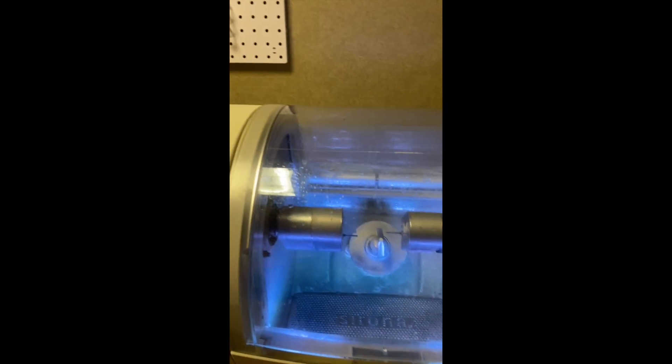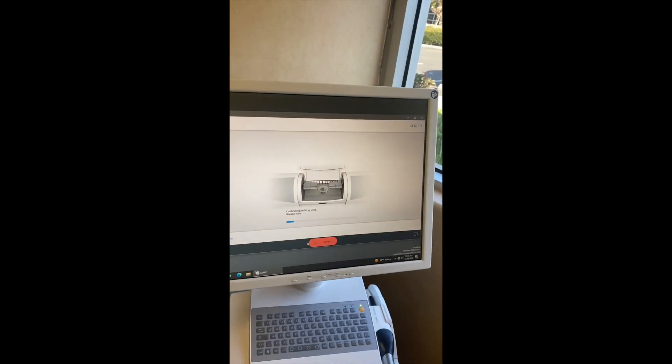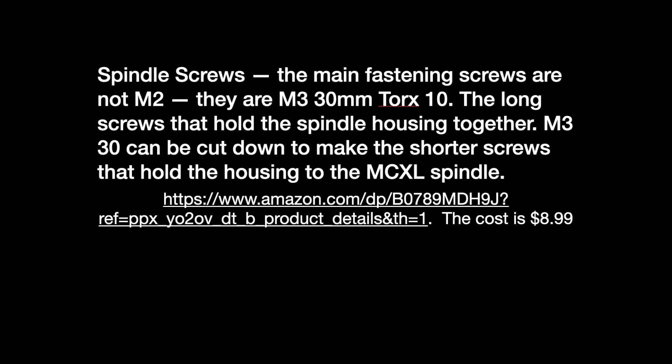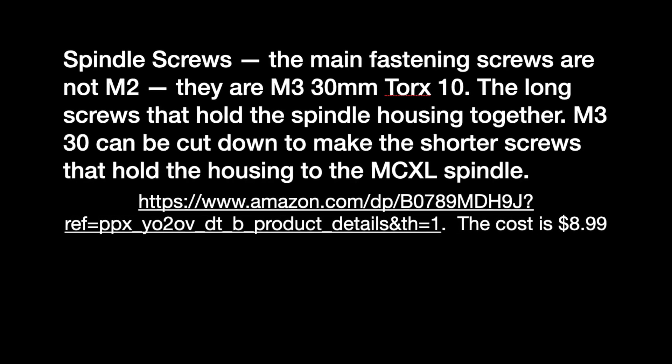It's very important that after you finish installation of the new spindle motors, you run through a calibration sequence. That's what we're going to be doing here with this MCXL — checking the calibration. There might be minor changes from swapping that motor, probably tenths of millimeters, but you want to make sure it's accurate when milling out a crown. Run through your calibration program — it's built into your unit. And that's it. We finished the installation of the spindle motor.